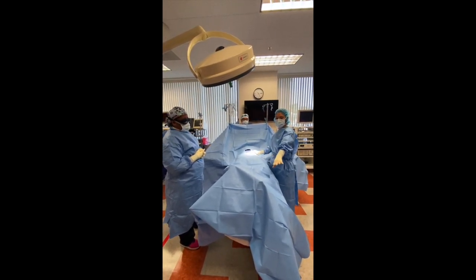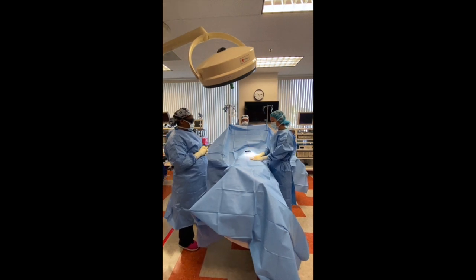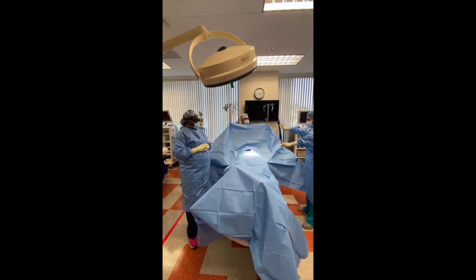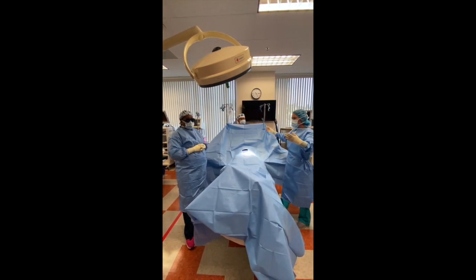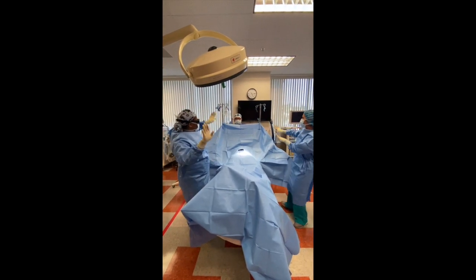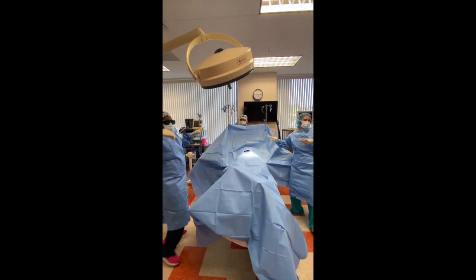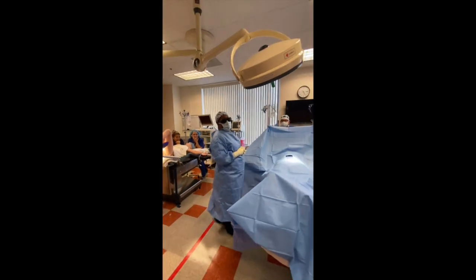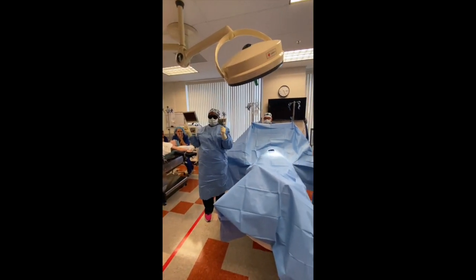You don't have to — you have the edge of the drape here. Just stay on top of the field, on top of the patient, and come out here. You're still on top, and you go. Cuff, cuff — this is the motion. We're going to do a wrap video. Any other questions or concerns at this point?